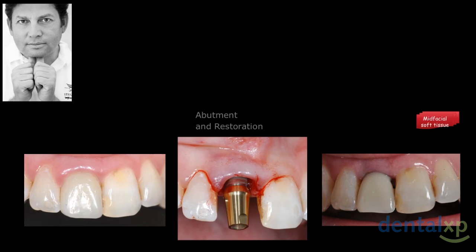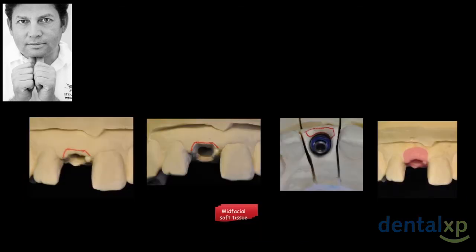Many years ago, we placed an implant, and then the soft tissue contour has to be developed. First, I'm looking at the zenith. This is with the subtraction methods. Then I'm looking at what are the borders inside the emergence profile, which my abutment shouldn't cross, and today we do that digitally. I want to show you analog. And then the compression of my crown, because I don't want to have the same emergence profile for an implant like a tooth. That was a big mistake. My lab technician used to cut at the cast and copy the emergence profile. I told him that's wrong.